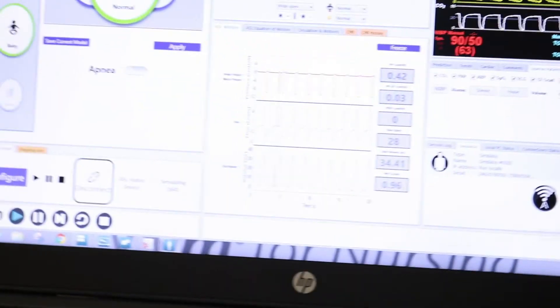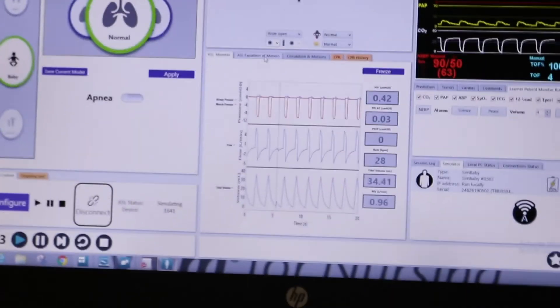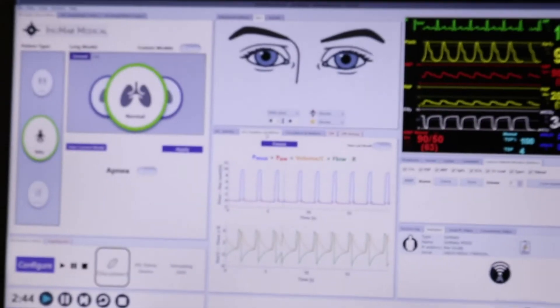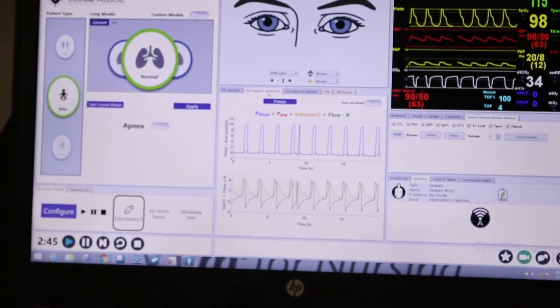It connects nicely onto a ventilator and it's got a piston-driven lung which allows you to change the resistance in each lobe of the lung or as a whole. And you can see if you look down, we've got the traces showing your flows and tidal volumes, and then we've got the equations of motion that you can use as well for teaching purposes.